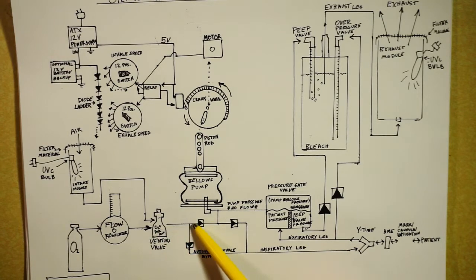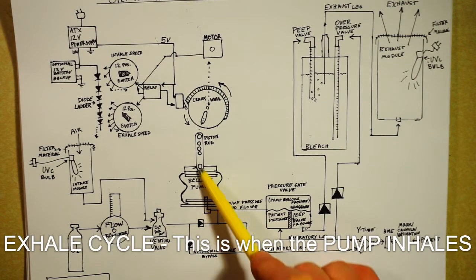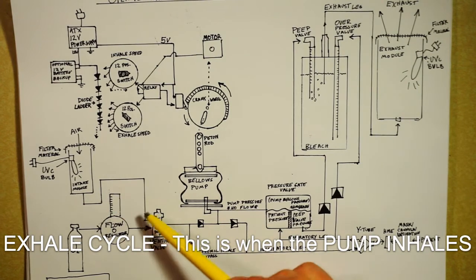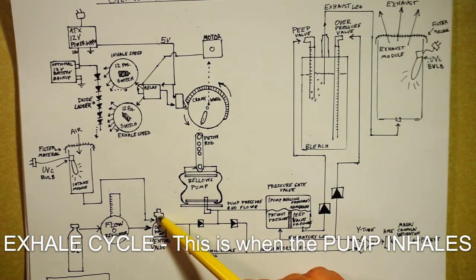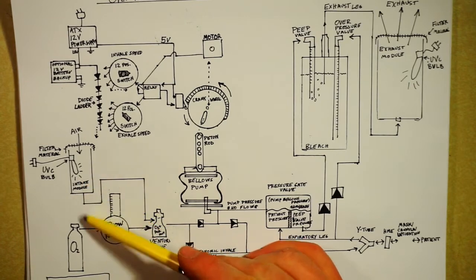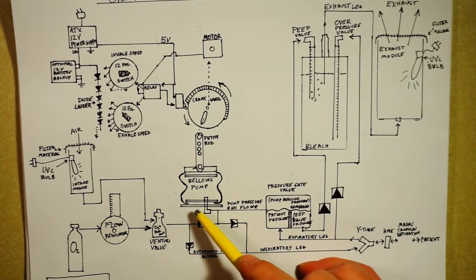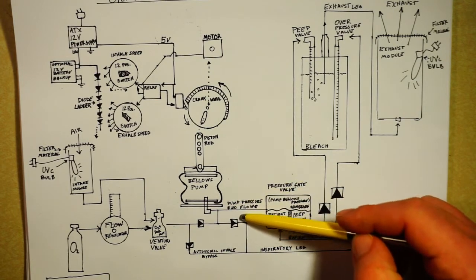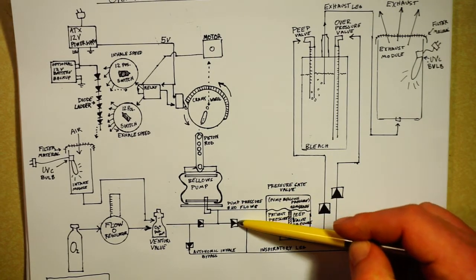But on the way in, we have a check valve to the pump, which allows on the inhale cycle for the pump to suck air in from the Venturi mixer, which sucks oxygen and air from this tank in the intake module. And then we have a check valve out so that when the pump is sucking in, it closes this check valve.